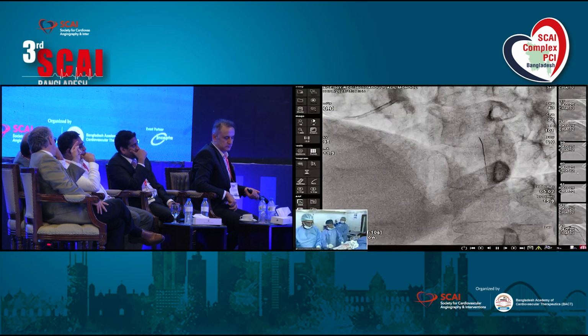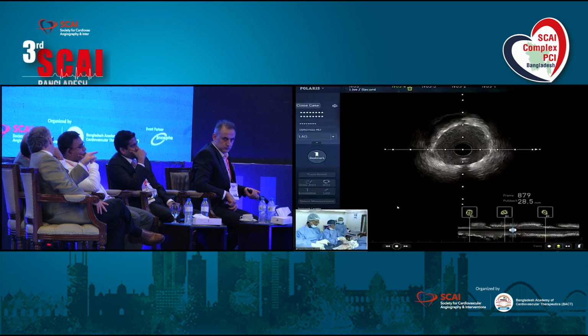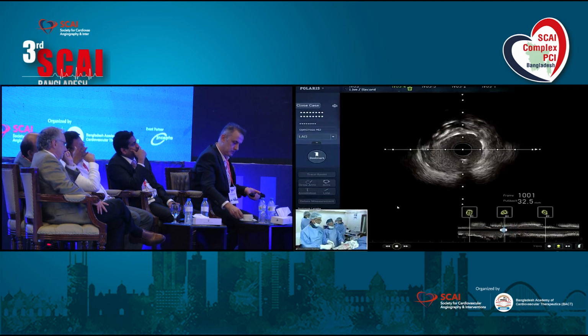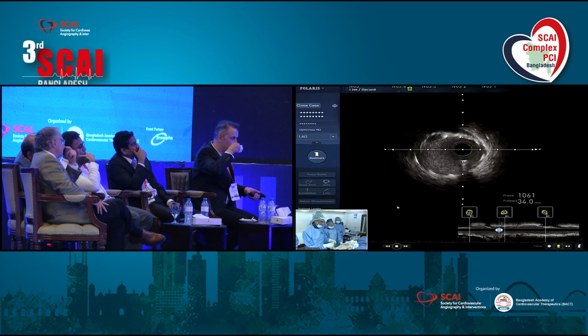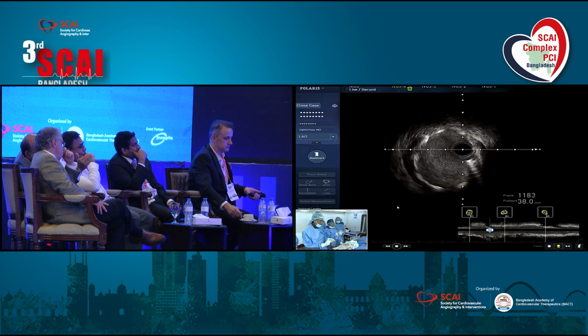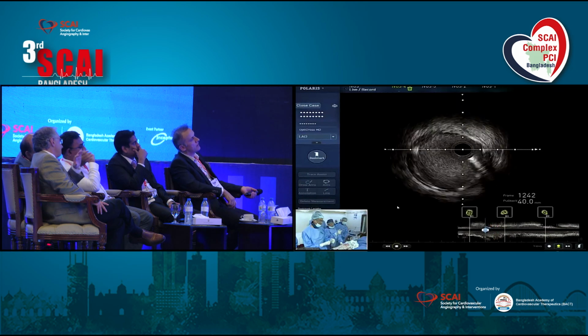No, we already took a final picture. We have taken a picture also. No, we did not see the final angiographic picture. We did not show it. Show them this view, please show them.